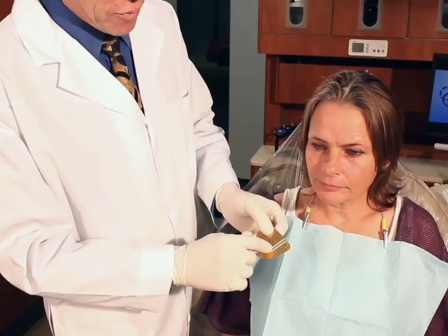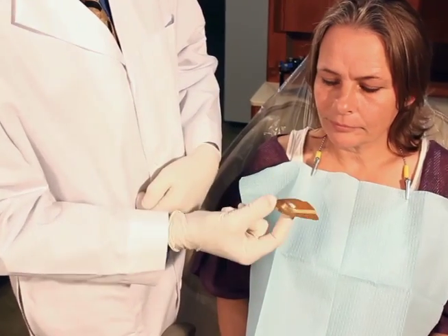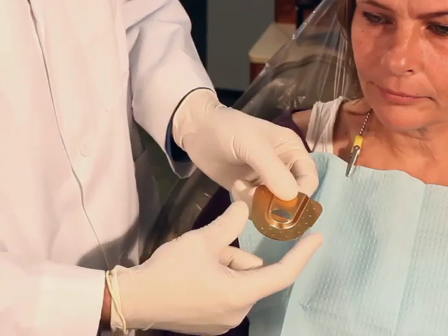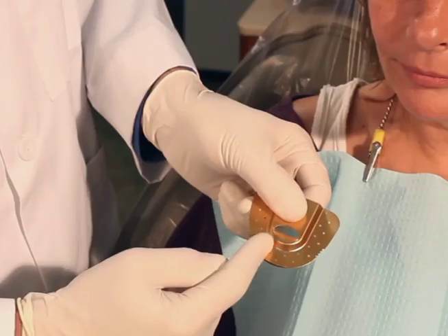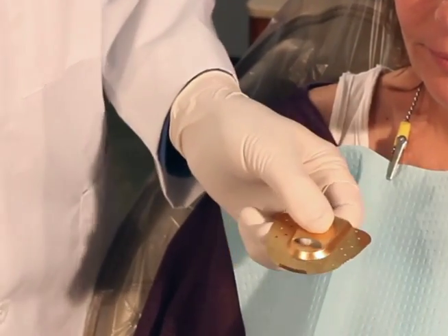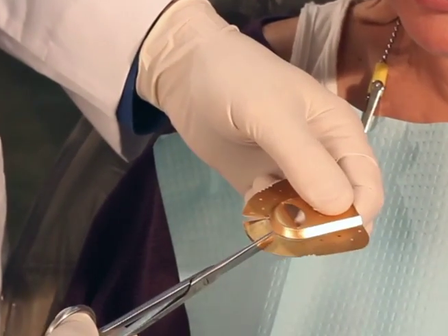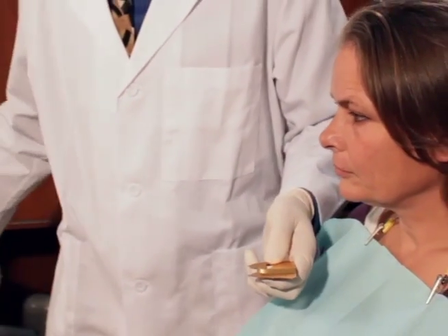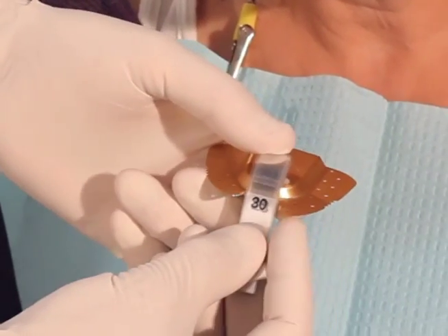There is a little half moon here that you can push down and then bend forward to create a little finger stop to help hold the tray. There are also little serrated edges on the side where you can grab the tray if you need to. There's also a little perforation here in the front where you can cut this with a pair of scissors and use it with a leaf gauge. You can just cut this section out if you want like this.